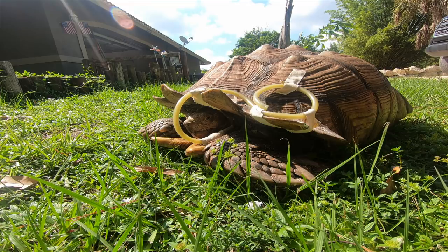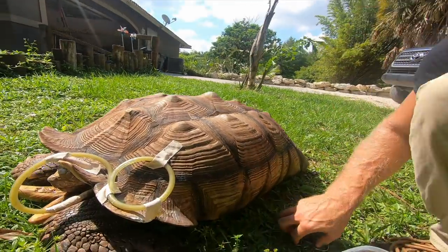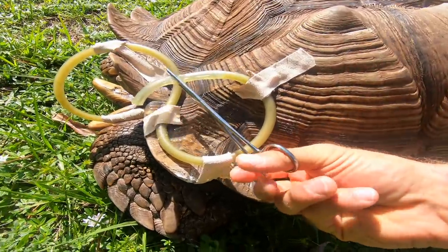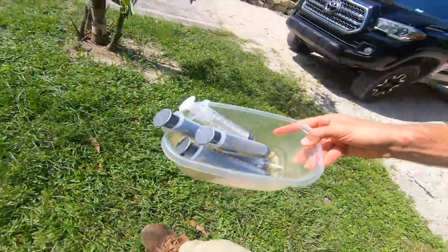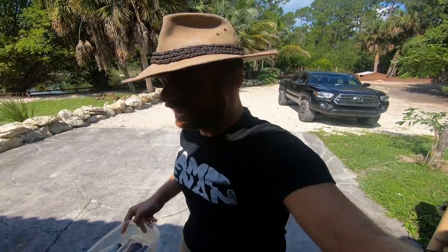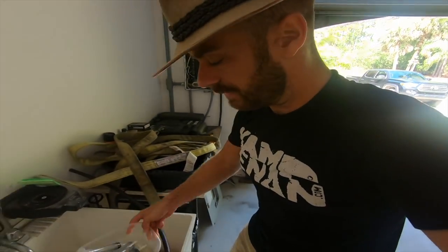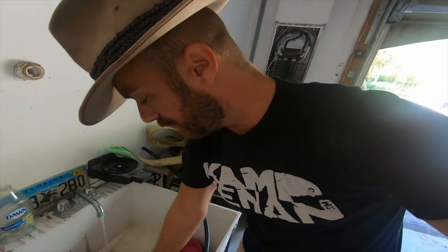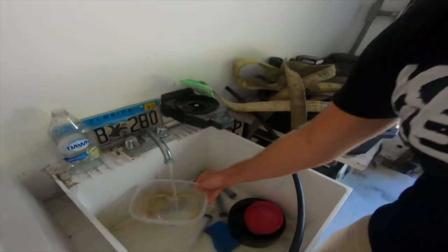So now what I'm going to do before I give him this injection, guys, we're going to go back. Oh, let me clamp this. See, this is why they give us the clamp, so you can keep it from dripping on them. So what I'm going to do now is go back and rinse this out, and we're just going to fill up a couple syringes with some water. This way we can flush out that food. We don't want that food to crust up inside the tube and cause a problem.